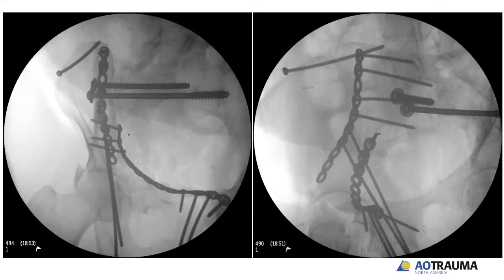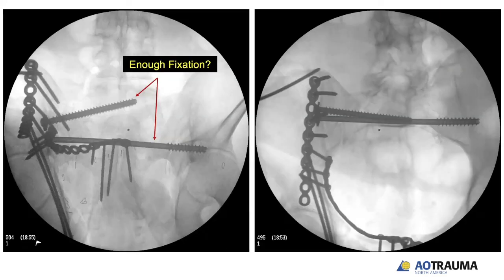Do you think on that fluoro view you're as happy with the position of the right sacral ala and its cranial position? Maybe that's just one view. Yeah, I think it's hard to tell on that one view, but I do agree it looks like it might be a little bit cranial. I think on that view it's a little bit high. Yeah, but your inlet view came together nicely. All righty.